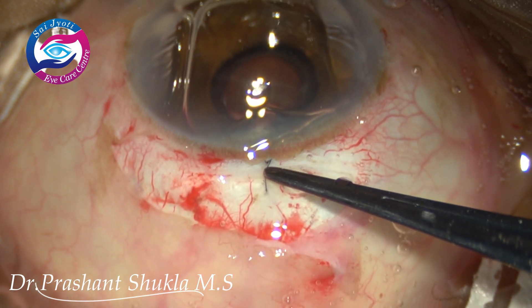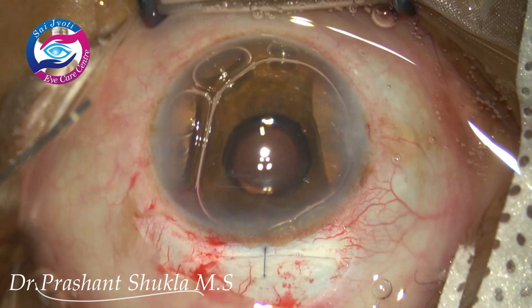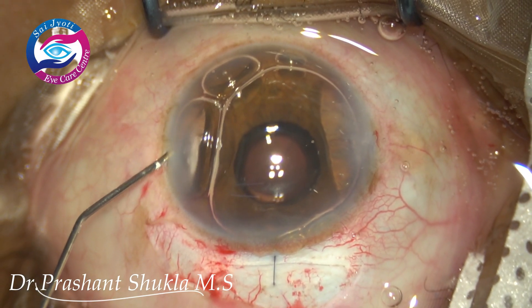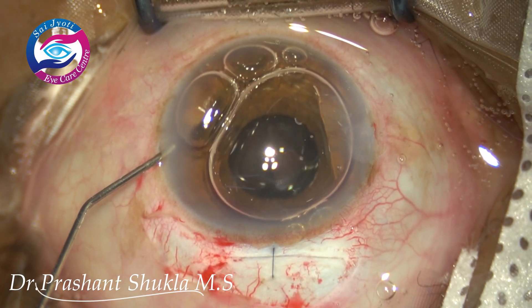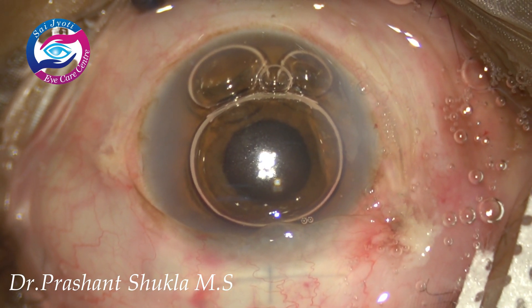The knot is being rotated into the sclera. Some ofloxacin is given. The conjunctiva is closed using cautery, and this is how the case looks at the end of the surgery. Thank you so much.